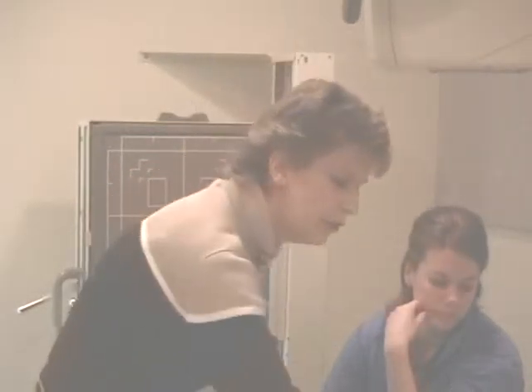Sometimes there's a bend to the forearm, and it's not possible to get a good AP wrist and a good AP elbow on a forearm, because again, there's a natural curve to the arm. That's where you focus on the joint that's nearest the injury site and make sure that's in a true AP relationship there. Okay? We've made our exposure, and now we're going to move our lead strip.